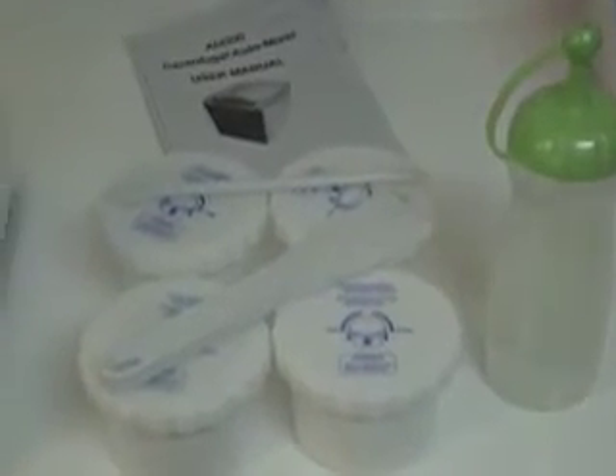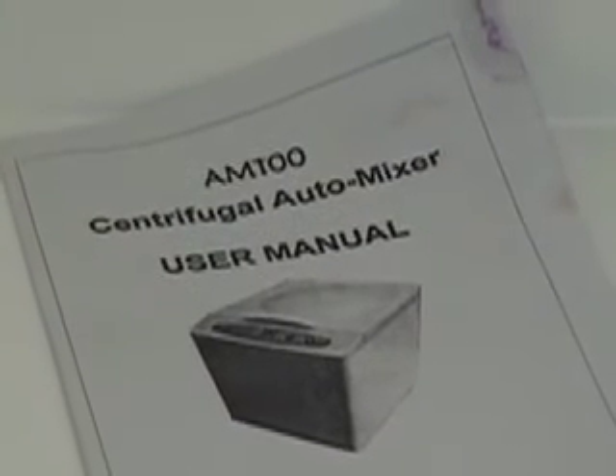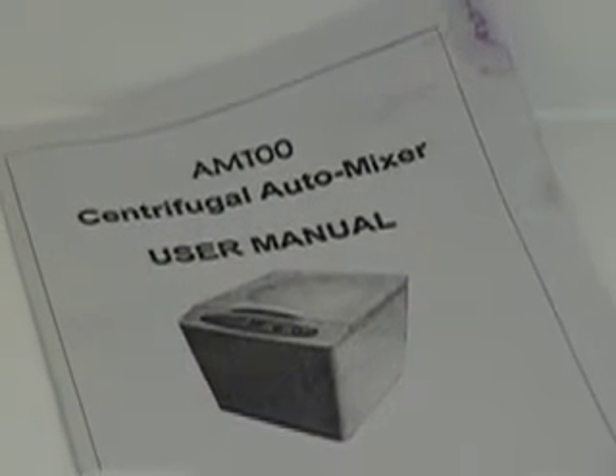The AM100 comes complete with four jars, two spatulas, a handy measuring scoop, a water bottle, and a very easy-to-read user's manual.